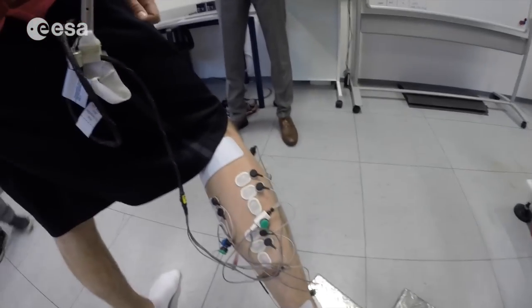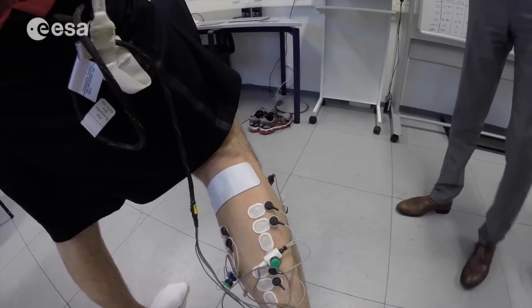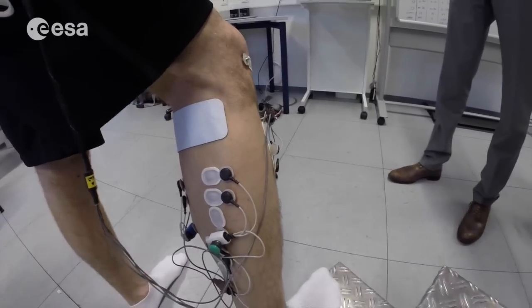The electrical stimulation is applied through a whole series of electrodes attached to my leg, and that's of course why it's necessary to shave almost the entire leg. We'll have to repeat that whole series of tests on board the ISS later this year, so it should be fun.